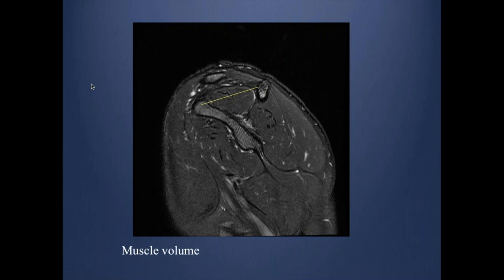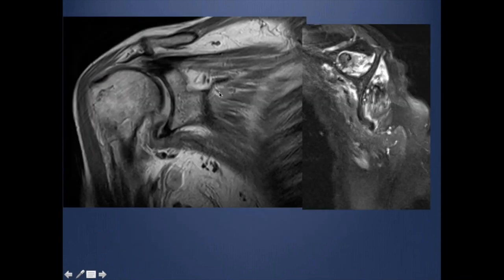How to assess muscle volume: there is a grading system, but generally, if you take the sagittal and draw a line between the acromion and the coracoid, the muscle belly should be above this line. If you look carefully here and draw the line, the muscle belly is clearly low and you can see fatty infiltration.